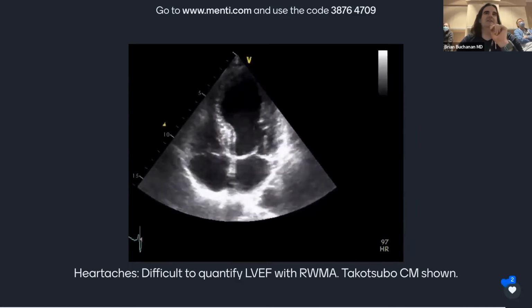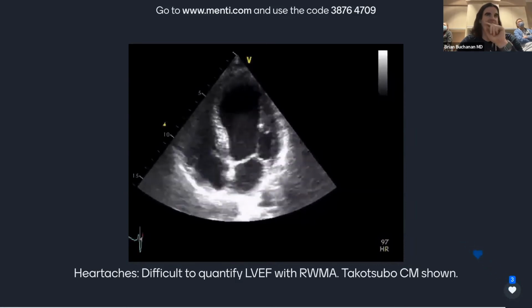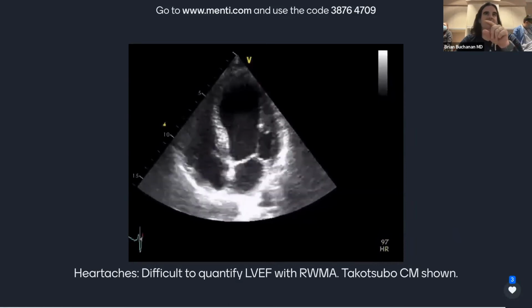Always be aware that you must rule out coronary disease to make this diagnosis, because patients can have multi-territory findings with certain kinds of left-sided disease. But certainly this looks pretty suspicious.